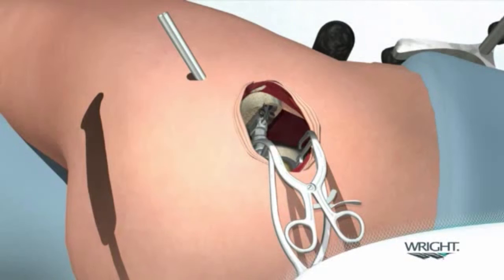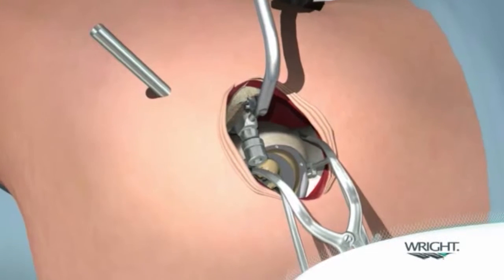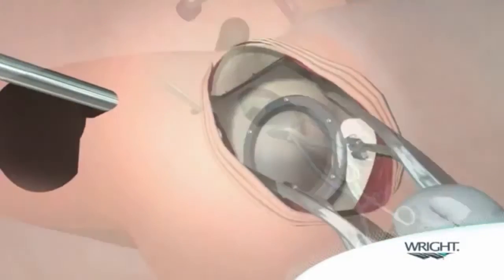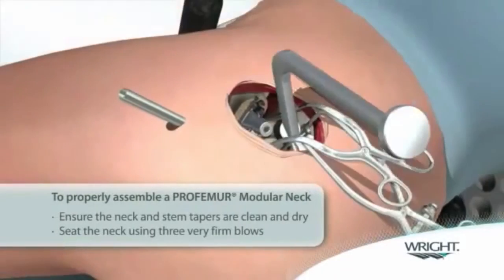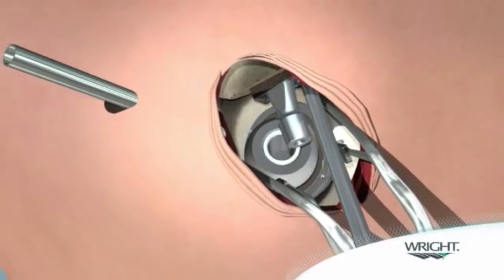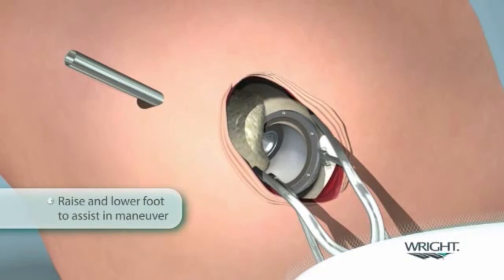With the leg returned to the home position, the bone hook is inserted into the broach and lateral traction is applied. The blunt trocar is inserted into the hole of the trial neck and the bone hook and blunt trocar are leveraged against each other to disassemble the trial neck from the broach. After removing the broach, the femoral stem and acetabular cup implants are impacted into position. The modular neck implant is then seated into the femoral stem and impacted firmly using the offset neck impactor. The femoral head implant is placed into the cup with the opening in a superior posterior position. With the tip of the blunt trocar inserted into the top of the stem, the leg is translated to mate the modular neck into the femoral head. Raising and lowering the foot of the operative leg again assists in this maneuver.